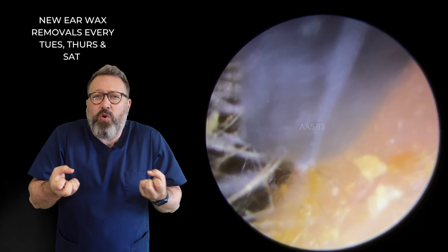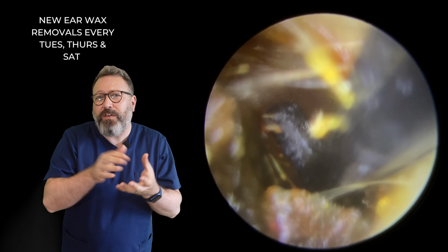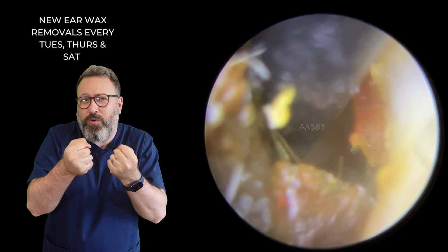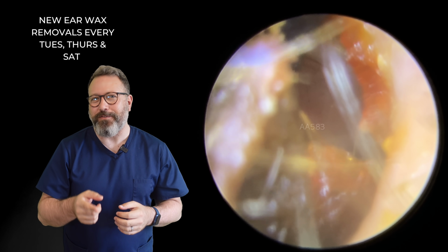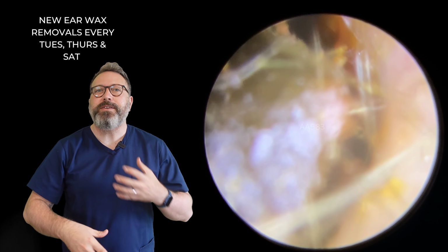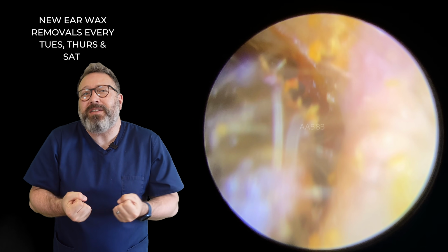It does tend to draw a lot of the oils out of the wax and dry it out. Perfect for the St. Barts hook. We've got this really tough old lump of wax here. I think the St. Barts hook's been out twice now. It doesn't come out very often, but it's been twice in this video. So we're really starting to detach this, roll it. Now this was dried solidly onto the canal wall.